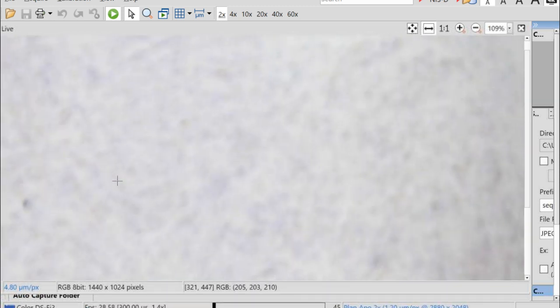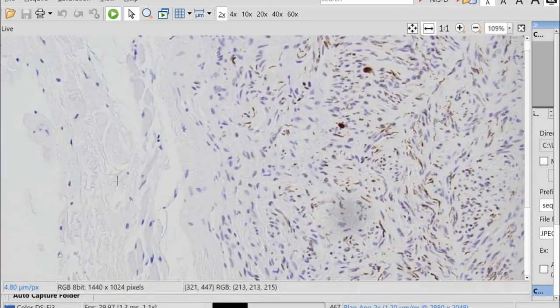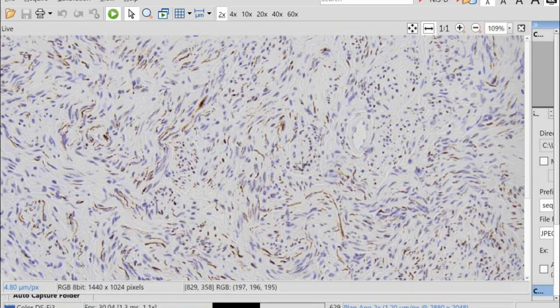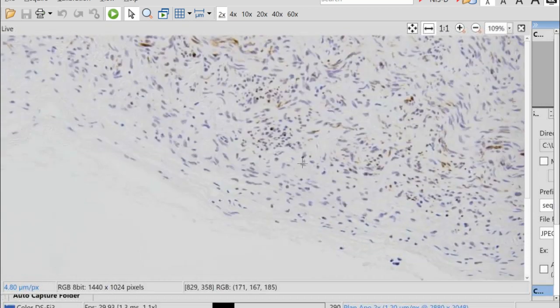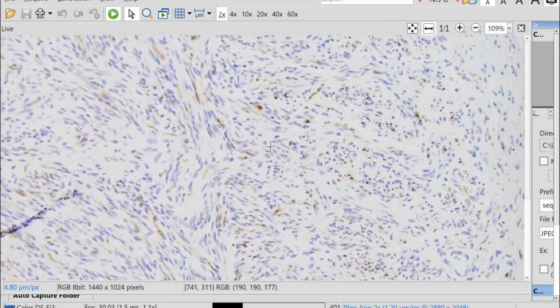And this is neurofilament protein, which we use a lot to outline axons. And actually here you have numerous axons coursing through the tumor. Usually, schwannoma, which is the main differential diagnosis here, can have a few entrapped axons, but it tends to be a solid tumor that displaces axons when it's growing. This one looks like a schwannoma a little bit, but you are seeing that it really has a high axonal density. And those areas in the periphery that look like little fascicles almost look like little mini fascicles. So that is what is unique about this.